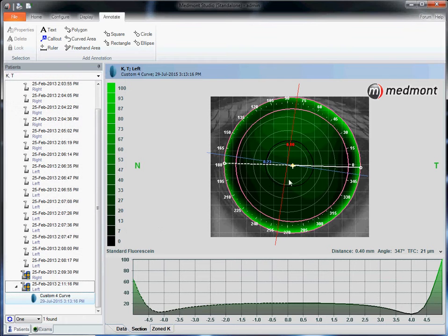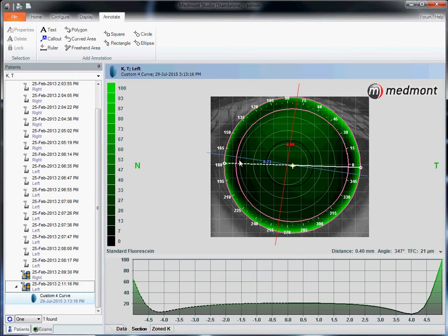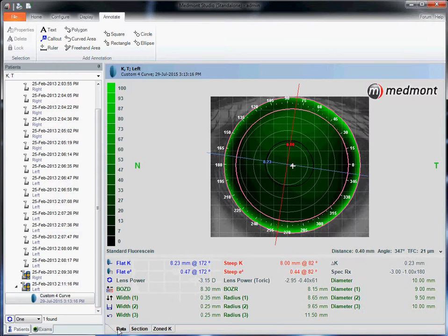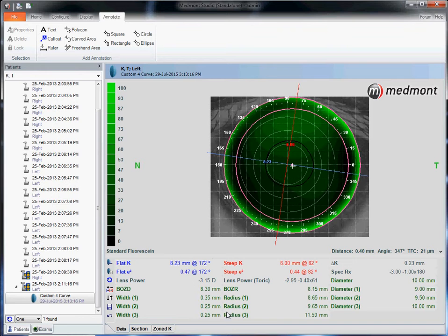Once you've designed the pattern that you would like to see both here and with the tear film profile at the bottom, you can go to data and all the lens specifications that you'll need are here.